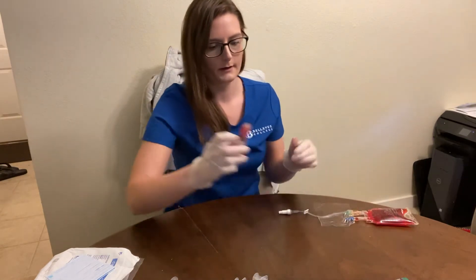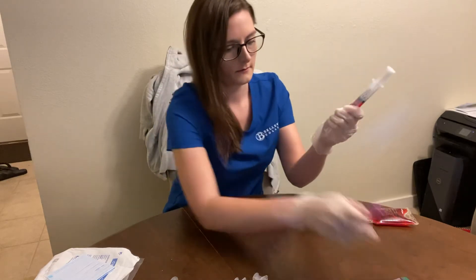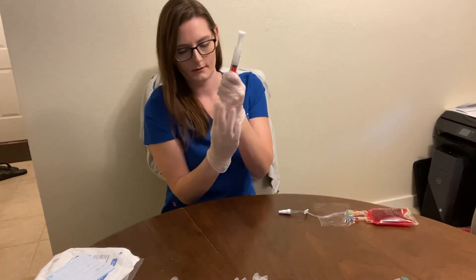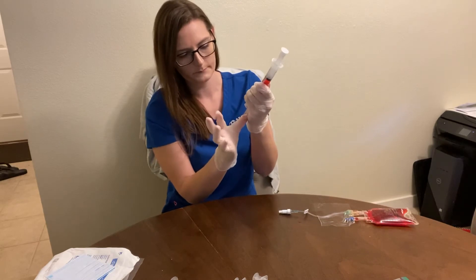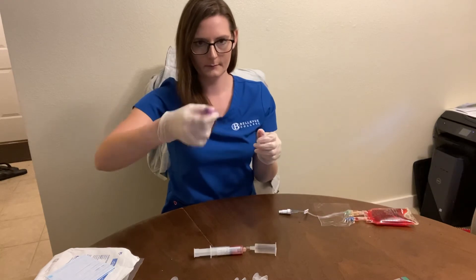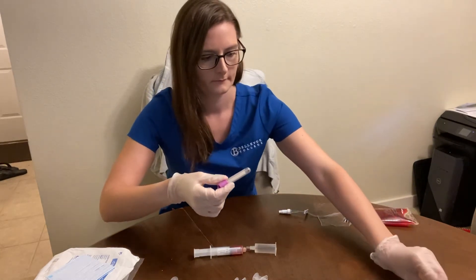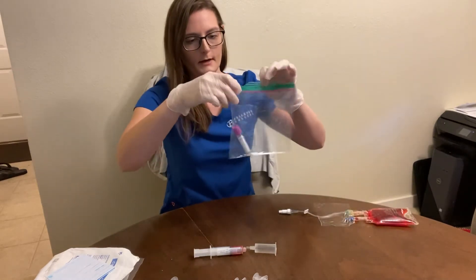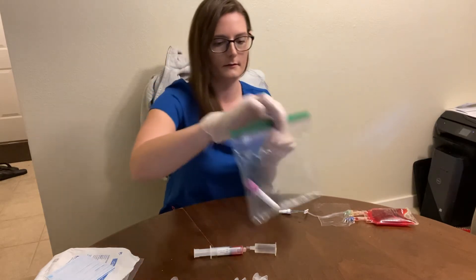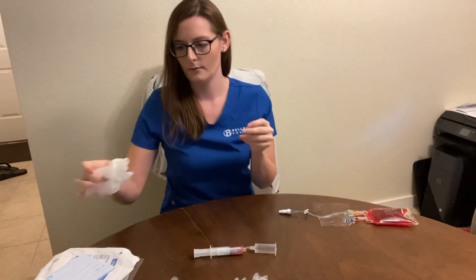Then I would put the cap back on. I would get my blood and attach it to the vacutainer, get my tube, and wait for it to fill up. Then I would invert it eight to ten times, label it, stick it in the bag with the time and date, and send it to the lab. Then wash my hands.